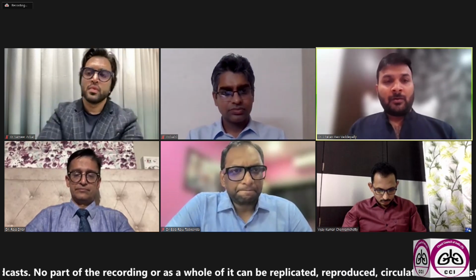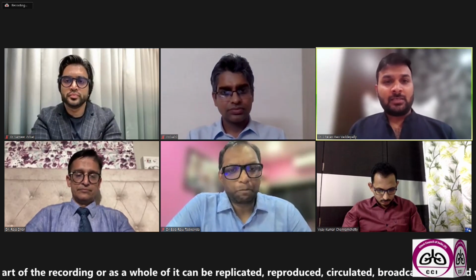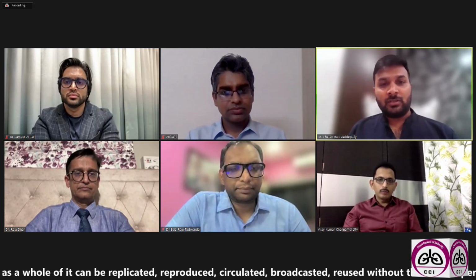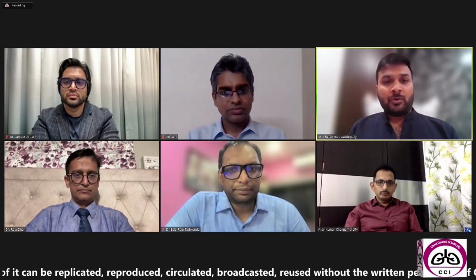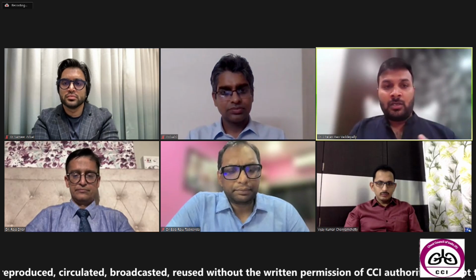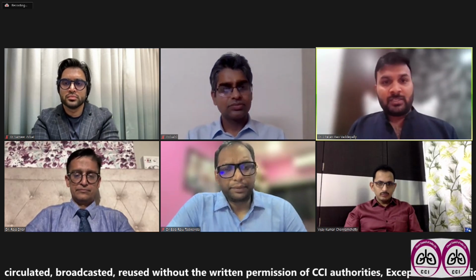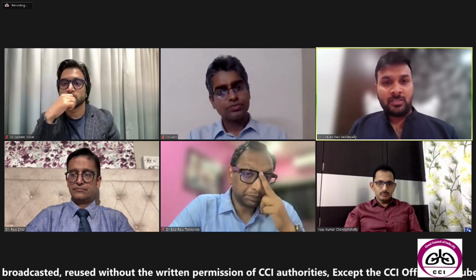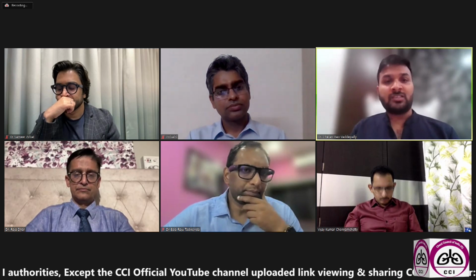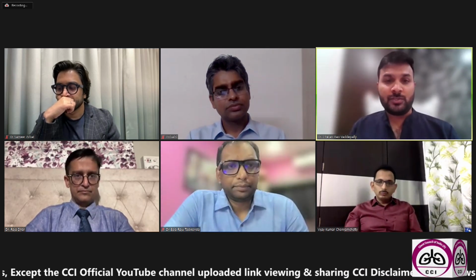This has come from the fact that nitrous oxide has persistent airborne spread for some time after the procedure, and there were reports of short-term behavioral changes and long-term reproductive effects of nitrous oxide. At the concentration that is present after the procedure, it is considered hazardous. So that's the reason it is replaced with carbon dioxide, because even if carbon dioxide persists in the environment of the operating room, it is not hazardous. And currently the Cryo 2 Pro system is compatible only with carbon dioxide, and we don't have any other option.